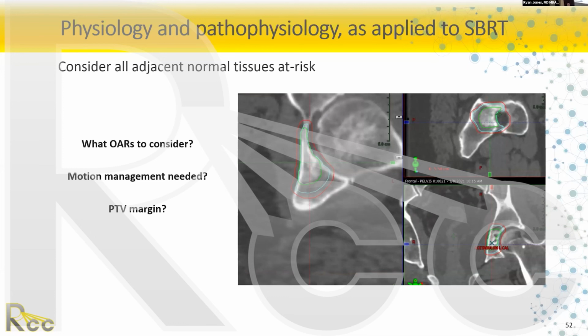This was another oligometastatic patient. So we were taking a little more risk in delivering this ablative treatment because this was the only known site of metastasis this patient had. I contoured gross disease, as seen on my PET and MRI that I had for this case. I put a CTV margin around it, as I talked about, for bone. That's my style, I was trained for bone. And a small PTV of 3 millimeters. I felt like I'd be able to keep them still.